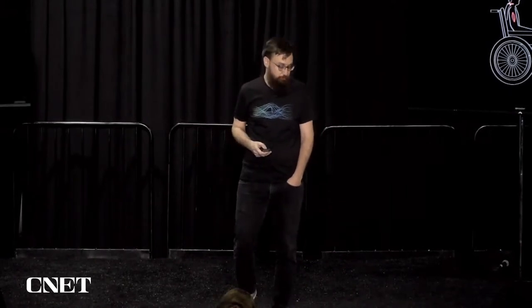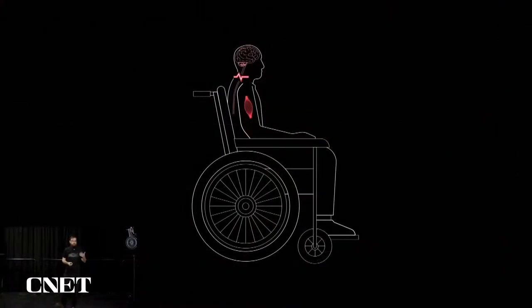So my name is Joey. I'm a neuroengineer, and I'm the head for the next-gen team at Neuralink. So for persons with spinal cord injury, the connection between the brain and the body is severed. The brain continues functioning normally, but it's unable to communicate with the outside world. You've already heard about how we can use the N1 link as a communication prosthesis to help someone with spinal cord injury control a computer or a phone, but it can also be used to reanimate the body. Let me show you how.